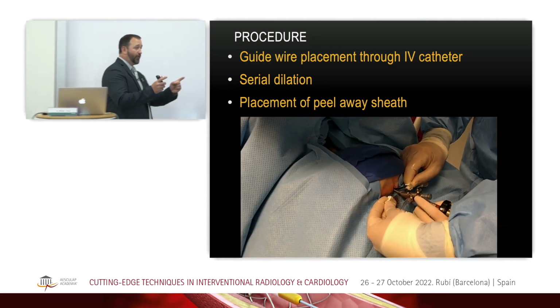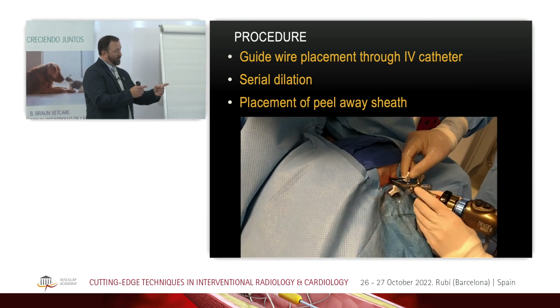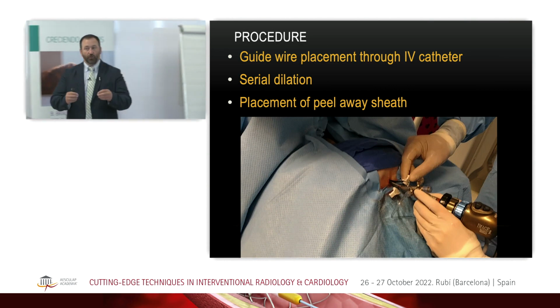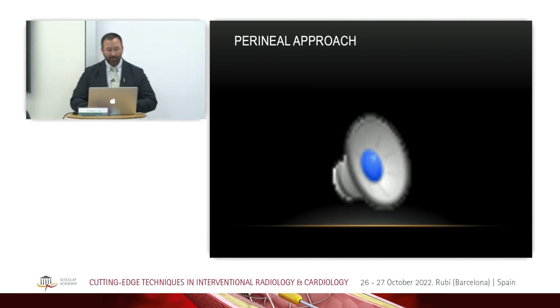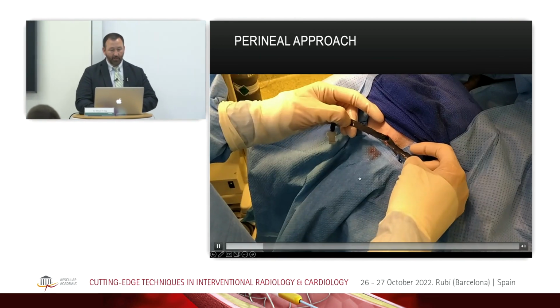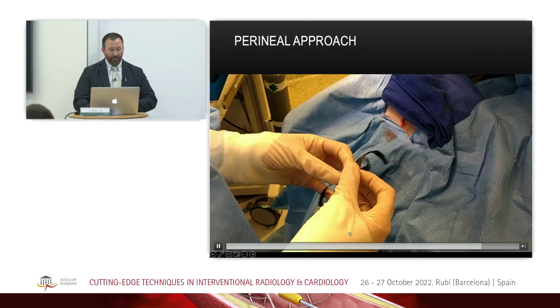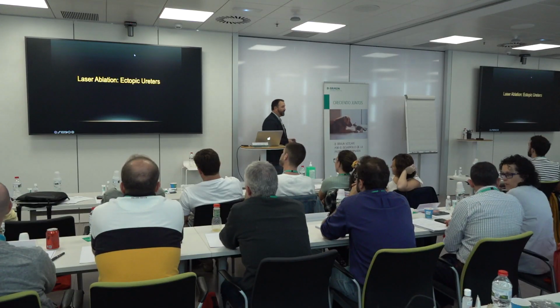It's a long sheath, so you're not losing it. You're just giving yourself access into it in the end, but the sheath's a good 8, 10, 12 centimeters long, so you're just tearing that most external 2 or 3 centimeters and then suturing those two wings to the edge of the skin there. And then again, the removal is just pulling it out, breaking it off, and then you're just left with your little skin incision there. Questions on that? Thoughts?